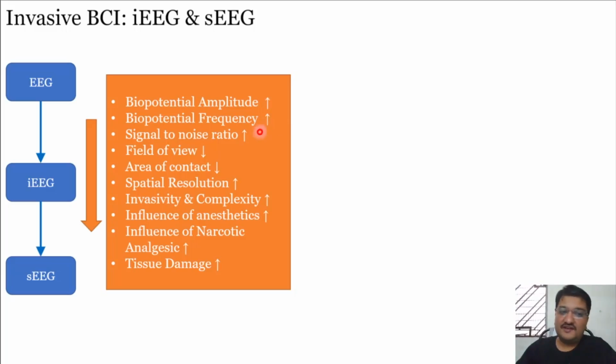One more thing is, for EEG, it's a recording from the scalp, so you will find more noise. It also has atmospheric dependency. Whereas with intracranial EEG and stereo EEG, you are going deeper inside your brain, so you get a prominent response, amplitude and frequency would be higher, and noise would be lesser. As a result, you will obtain a very nice SNR, signal to noise ratio.